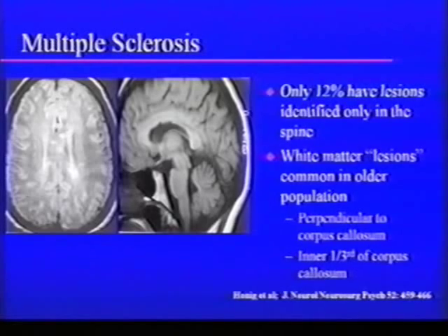It gets blood supply very nicely from the short and the long callosals from the top of the brain, the depth of the brain. One of the main reasons you get white matter lesions in the brain is atherosclerosis. So when you see lesions like this, you want to say, can I be pretty sure it's not atherosclerosis? A good way to tell is when you look at the sagittal MR, if you see involvement of the inner third of the corpus callosum. See how these look like little mouse bites, I guess you could call them?